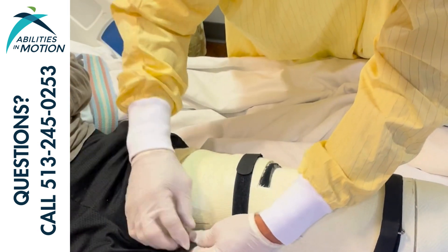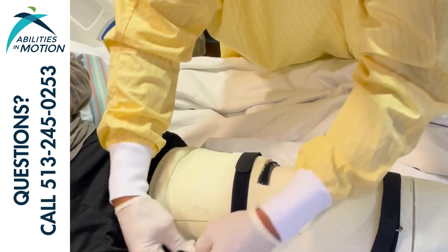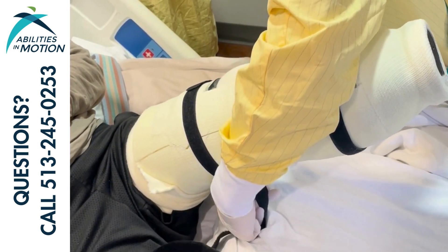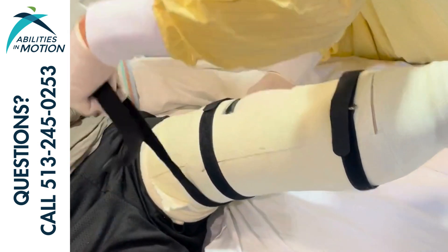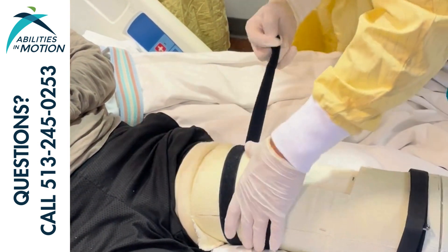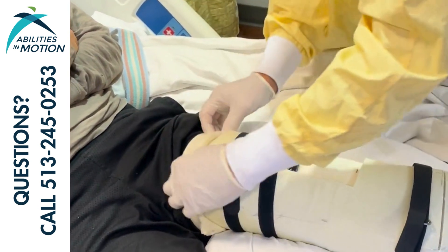We want to make sure the straps are all going in the right direction. They need to pass through that ring and tighten all the way. We want there not to be any gaps between the lid and the base of the cast.